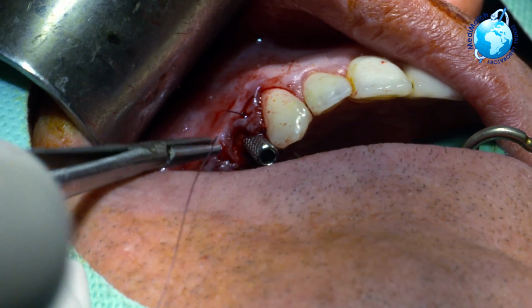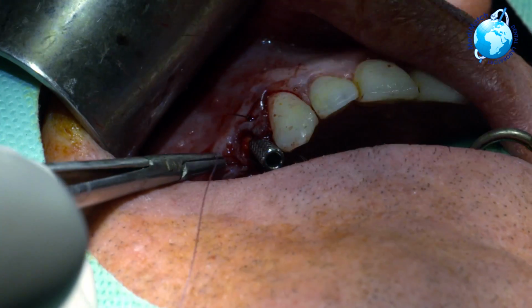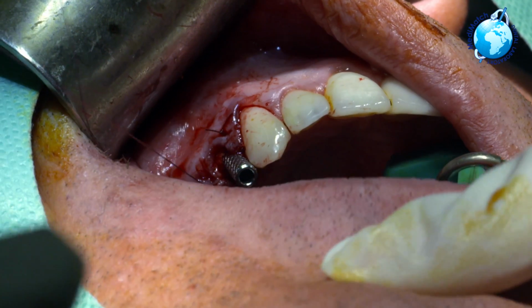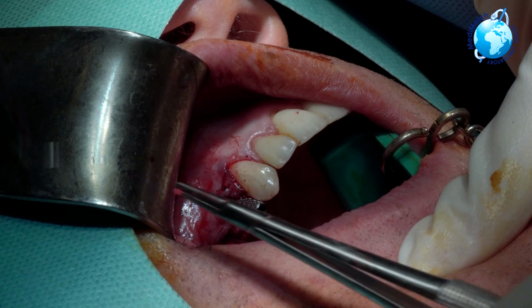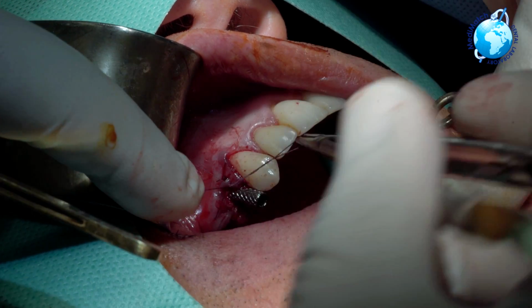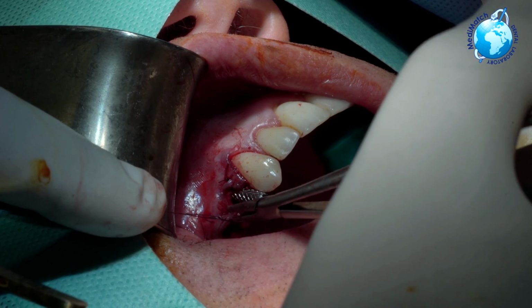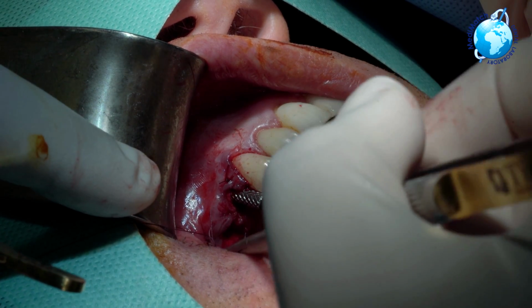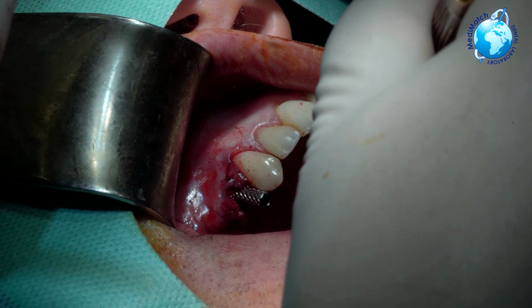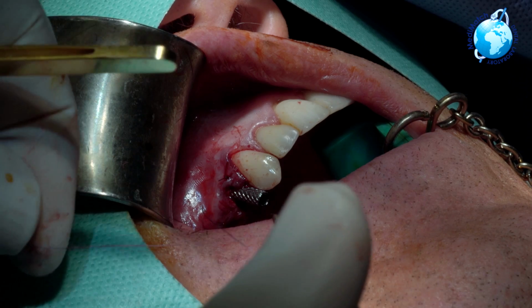There we go. Don't think that's through. Just to seal that. There we go. This loop. Is that closed?